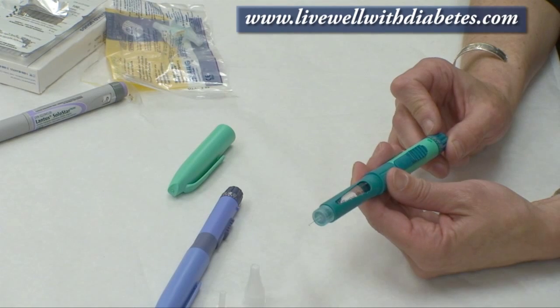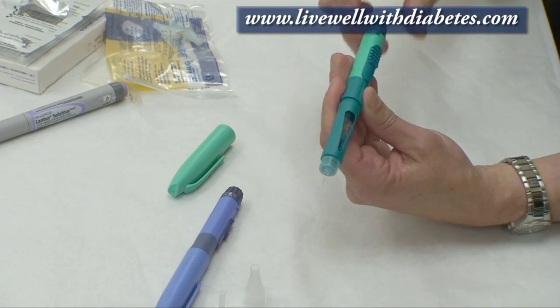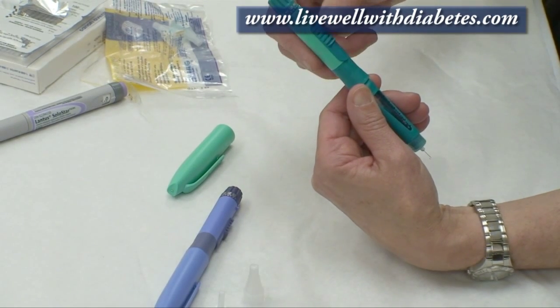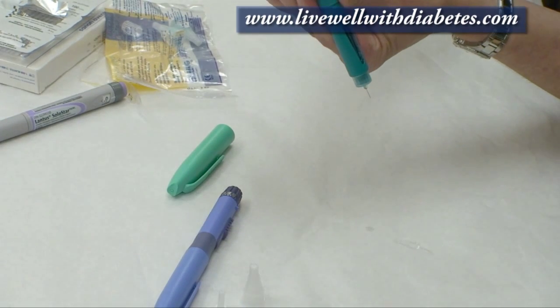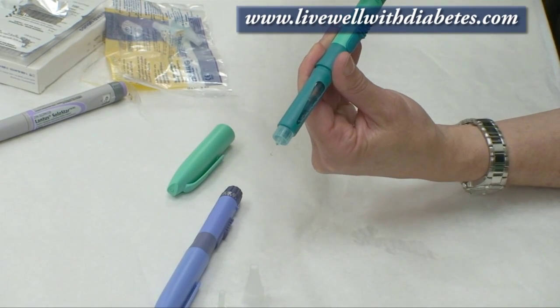This pen is a little bit different than the other pens. When you turn this dial there's not a button on the end to push. To dispense the insulin there is a slide button — where the grid area is, I put my thumb there and push, sliding it down, and the insulin will come out and the dial will return back to its starting point.